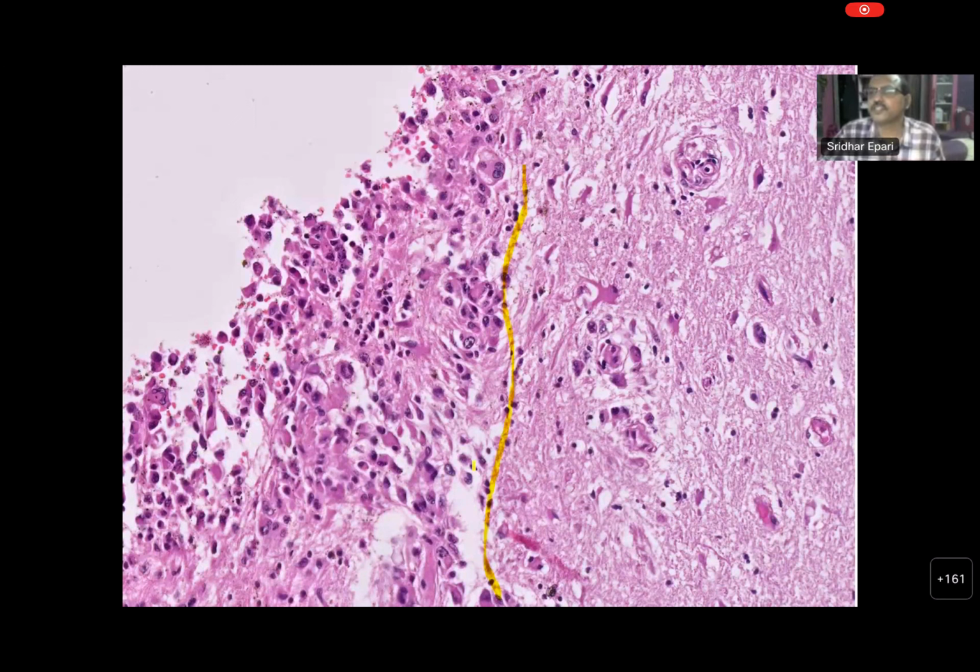So based on histology, we may not really call it a diffuse type, right? But it is a cellular tumor with high grade morphology. Whenever you have any high grade tumor, you avoid using the word circumscribed astrocytic glioma. Diffuse and circumscribed terms apply only as long as the tumor is lower grade.